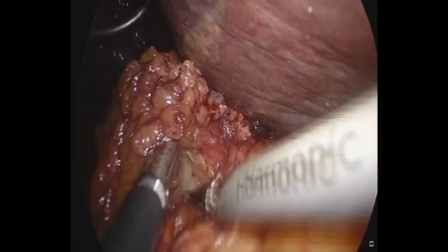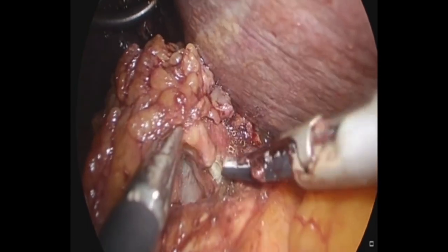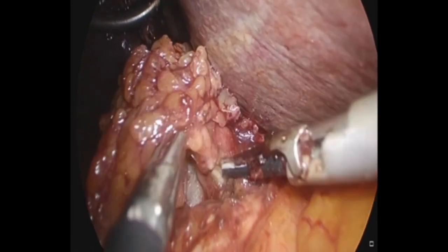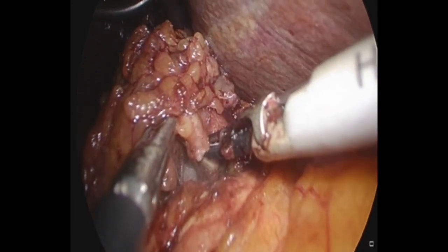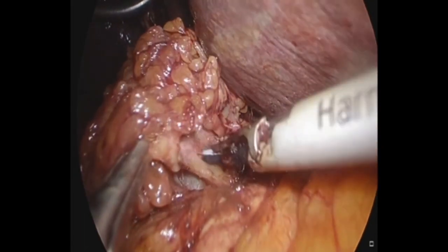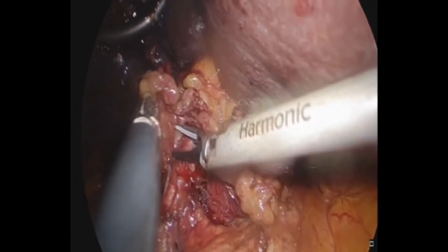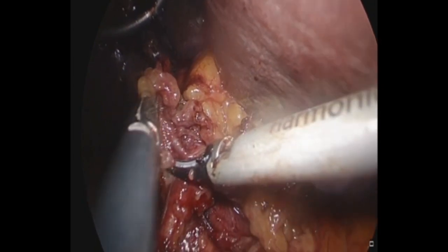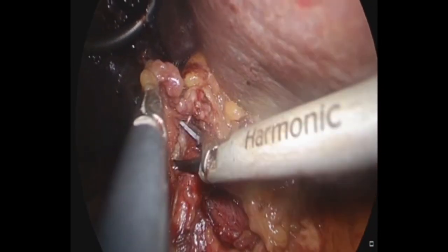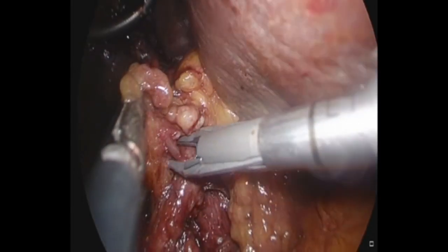The reason we use the Harmonic 1000i HD is because it has jaws just like a Maryland dissector, and one can take larger size 7mm vessels with the Harmonic HDI integrated handpiece system. The aim is to take off all the fibro-fatty tissues from the three important structures in the porta hepatis.